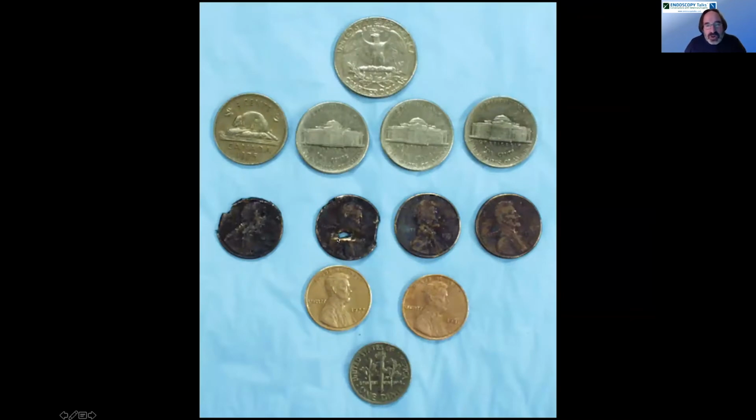Not from this dog, but from other dogs, to clearly show older pennies. On this row here, you can see that gastric acid just makes them nice and shiny, whereas the zinc-containing pennies minted in 1983 and after are clearly getting pitted and broken up by the acid. And for our international audience out there, you can also see a Canadian nickel at the same time in this dog.